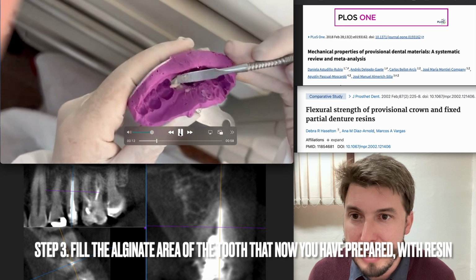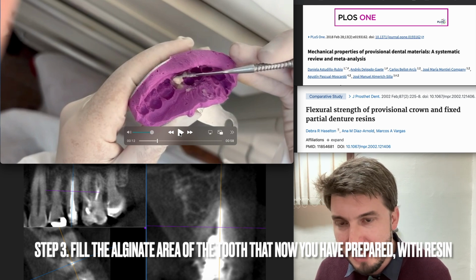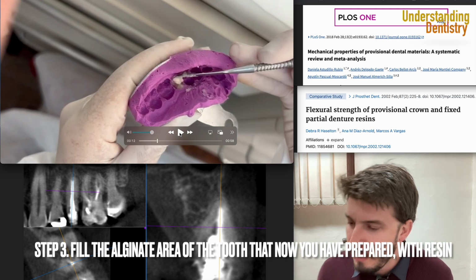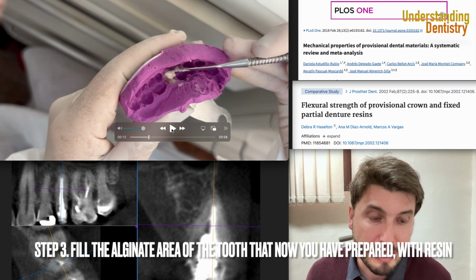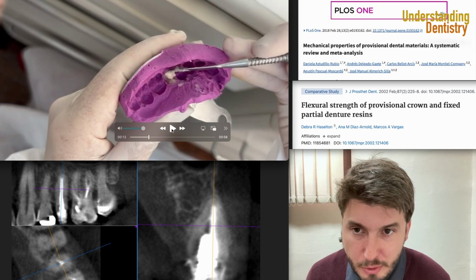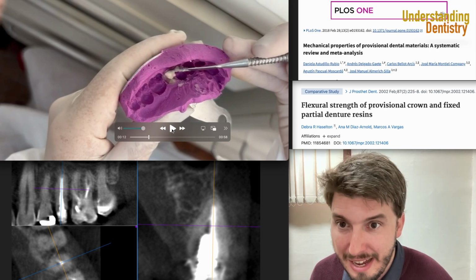So that's being done with acrylic resin. And don't forget that acrylic resin has phases, and one of the phases is an exothermic phase, so it will release heat, of course, and then we have a phase in which we can manipulate the resin a little bit better. There are people who prefer different phases of the resin to work, but we need to work with a phase in which we can manipulate the resin and give it shape properly. So we are now just doing the insertion of this material in the crown here, all right? And then, of course, this crown will be inserted back on the tooth after it is prepared. After prepared.